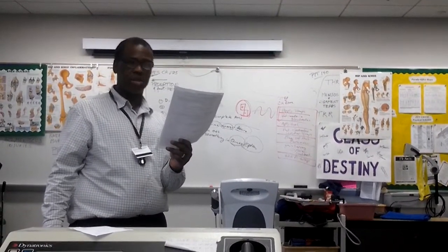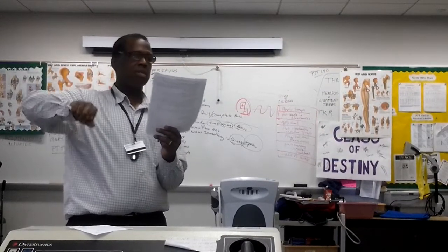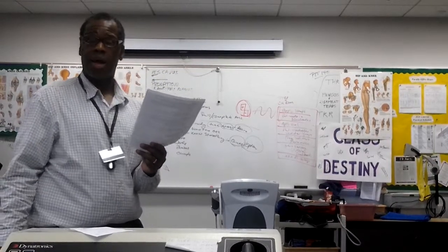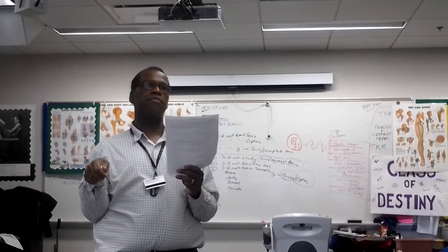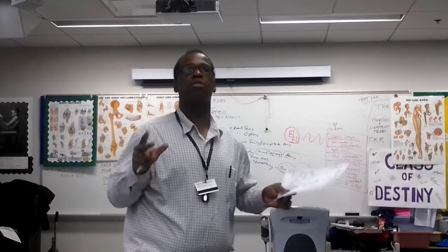Intensity or amplitude. What can that button cause or change? Spasm. Increase the tingling? Tingling or twitch. When I first turn it on, even if I have it on 250 microseconds and 50 pulses per second, the person is going to feel what?